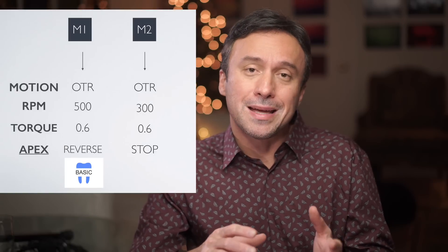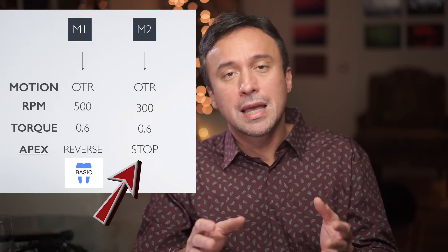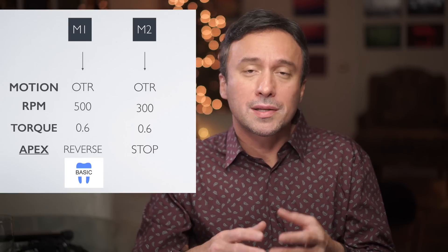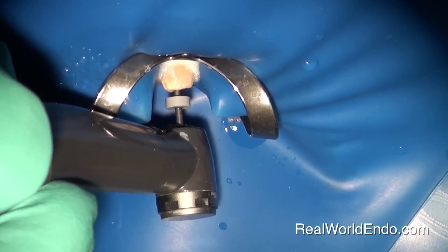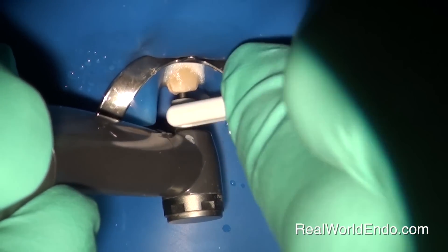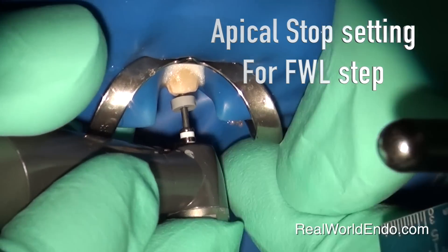I'm simply communicating the whole process and these steps in order to make it easier as to why we have different settings that are helpful for each step. Just keep in mind that during working length measurement, which is step two, I had recommended using the apical stop setting for the handpiece, which brings the file to a full stop once apex is reached and the apex locator tells the handpiece. This was so that the file comes to a stop, which allows you or your assistant to move that silicone stopper to a reference point in order to capture an analog working length measurement for your other files.